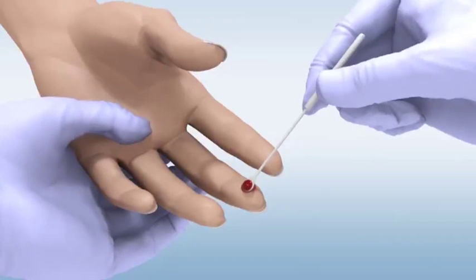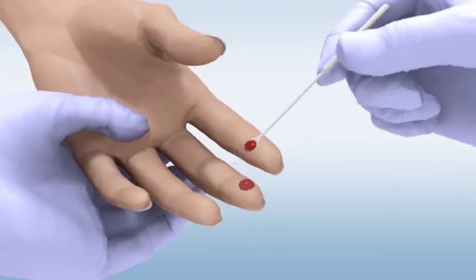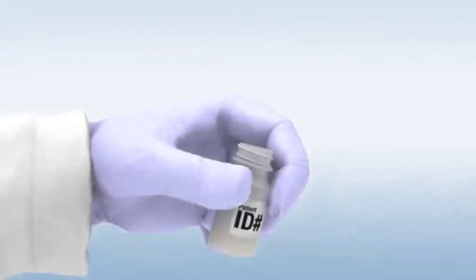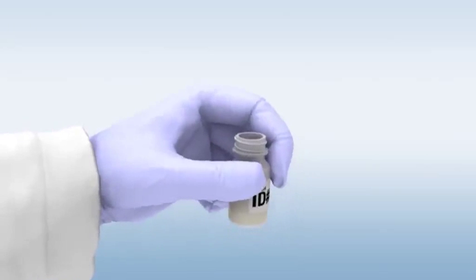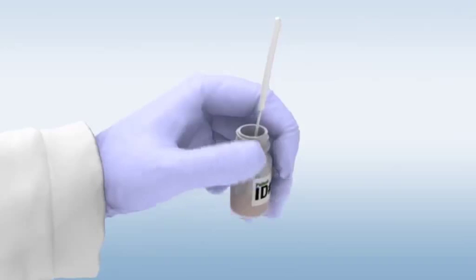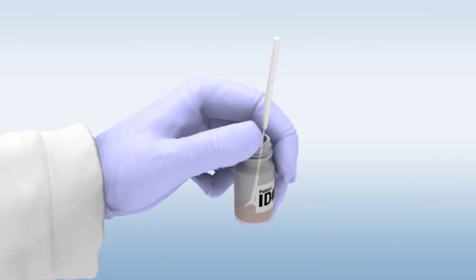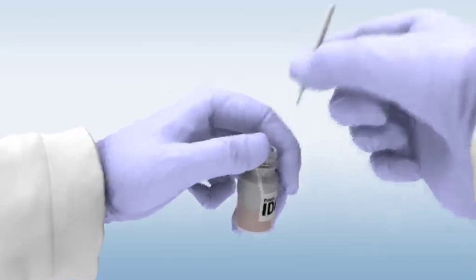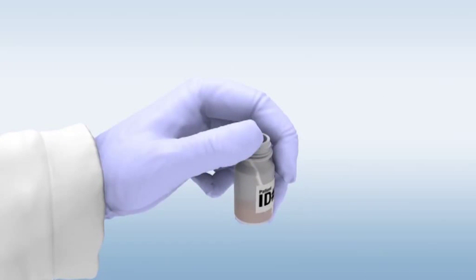Touch the sample loop to the drop of blood, allowing the opening of the loop to completely fill with blood. To transfer venous blood from a collection tube, use a 10 microliter lab pipette rather than the sample loop. Place the collected sample into the labeled black cap sample tainer. Ensure that the loop with the sample rests on the bottom of the bottle. Gently break the loop by applying pressure to the shaft at the brake notch. Discard the loop shaft into a waste container.